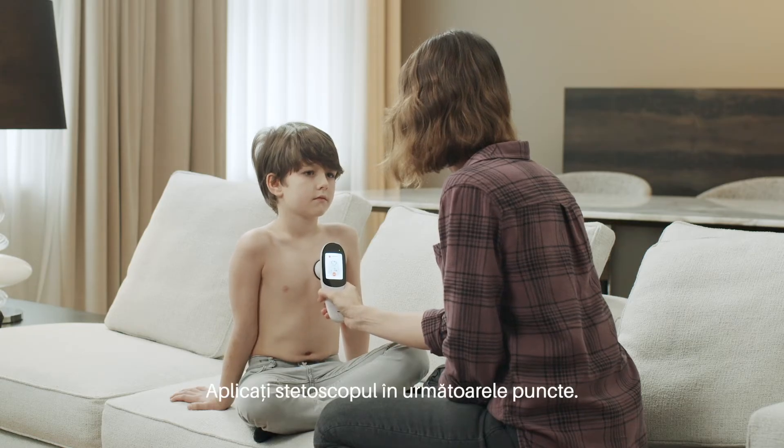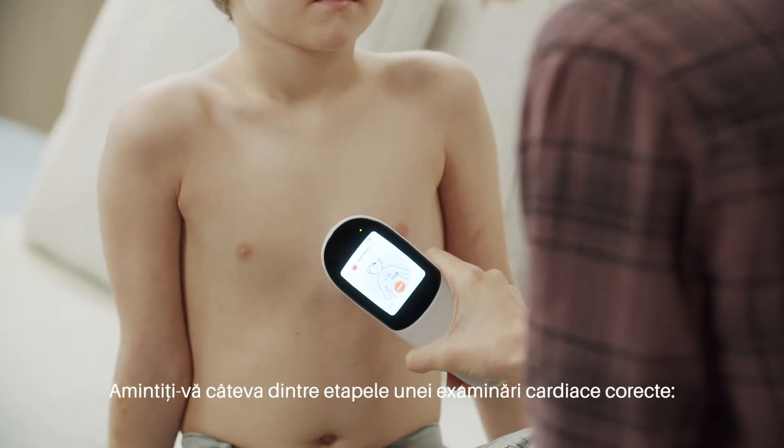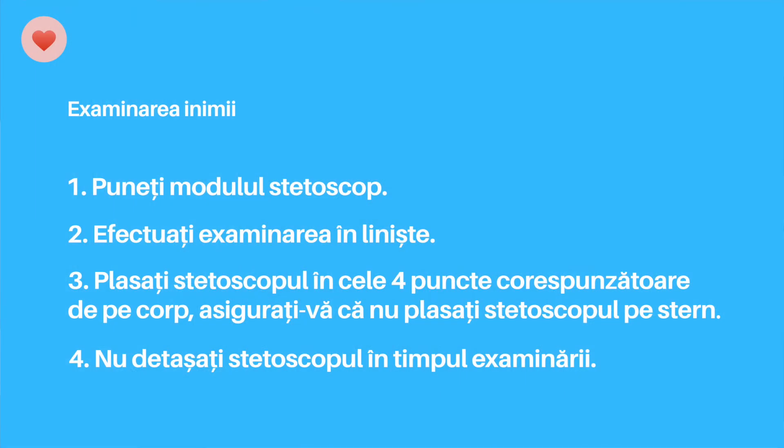Now move on to the other points. Keep in mind these few points to ensure you properly perform the heart exam: perform the exam in a quiet environment, and make sure you do not place the stethoscope on the sternum.